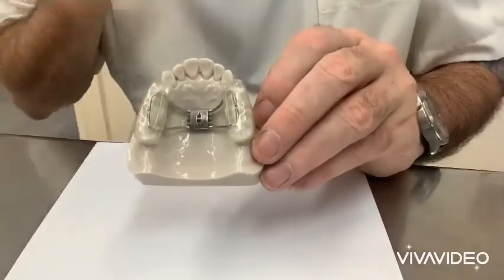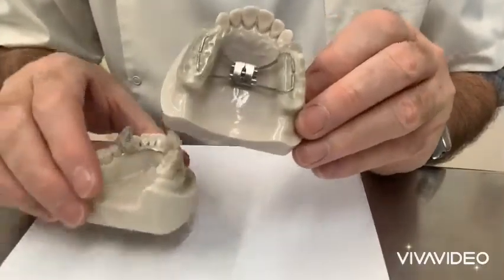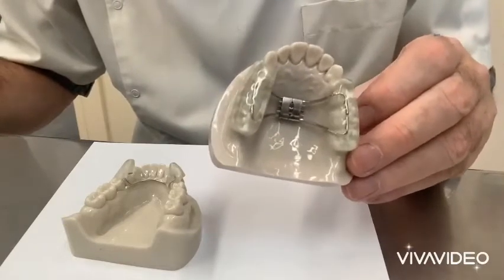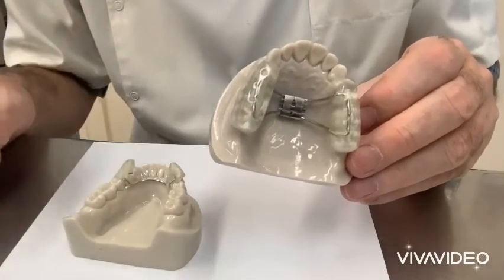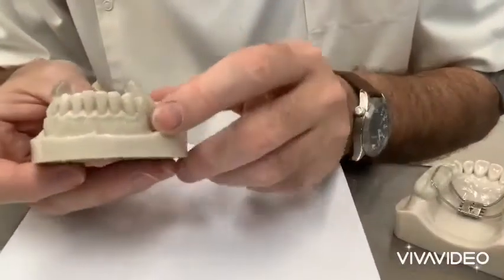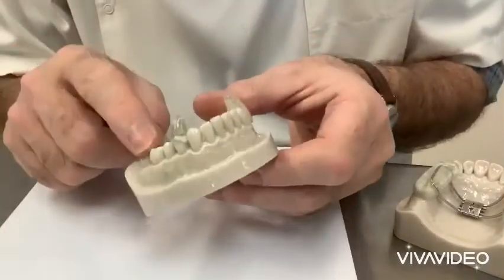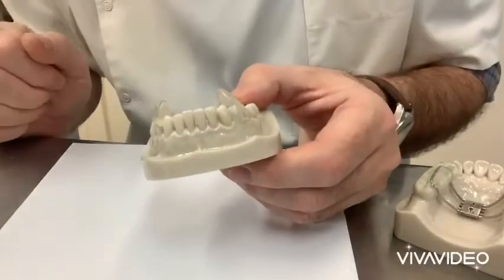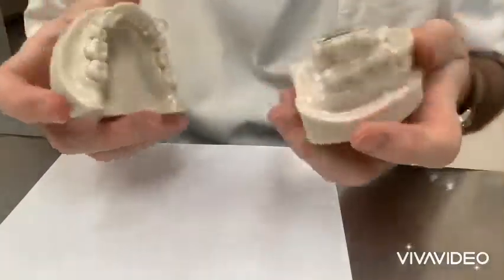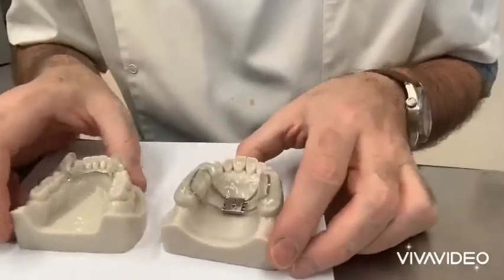So that's the fixed twin block. It's a really good alternative to a removable one. It's fixed in the mouth — the patient cannot remove it. And it's correcting the class two at the same time as you can be getting anterior alignment as well. Obviously on the lower, you could still put some brackets on the lower anteriors, put some molar bands on the sixes, and put your arch wire into those tubes on the molar bands. So that's the fixed twin block. I'm Graham Manley from OrthoLab.